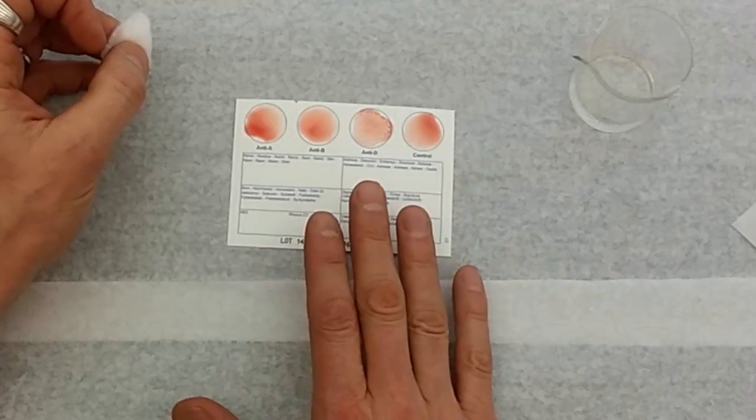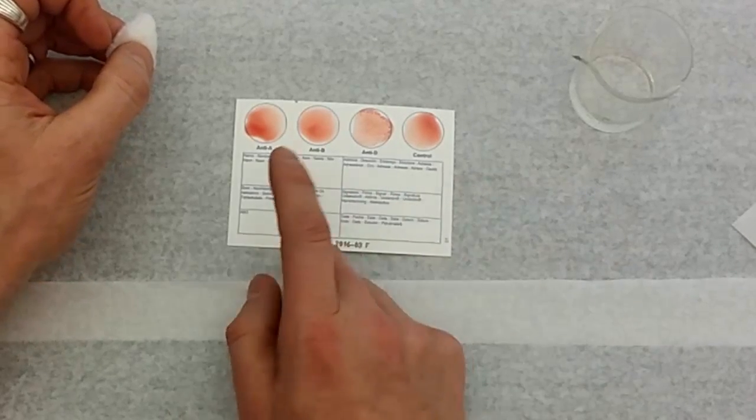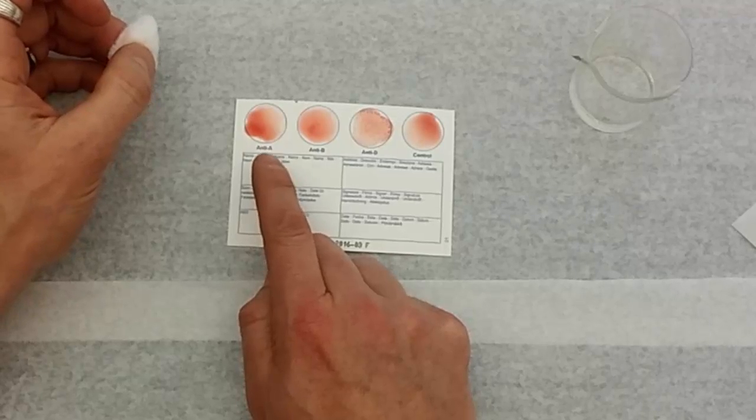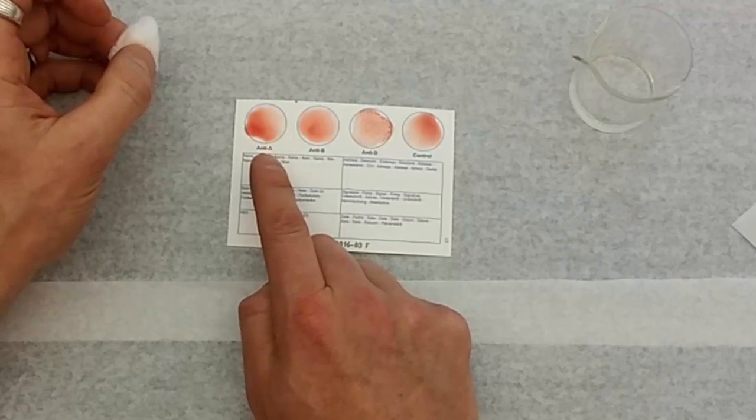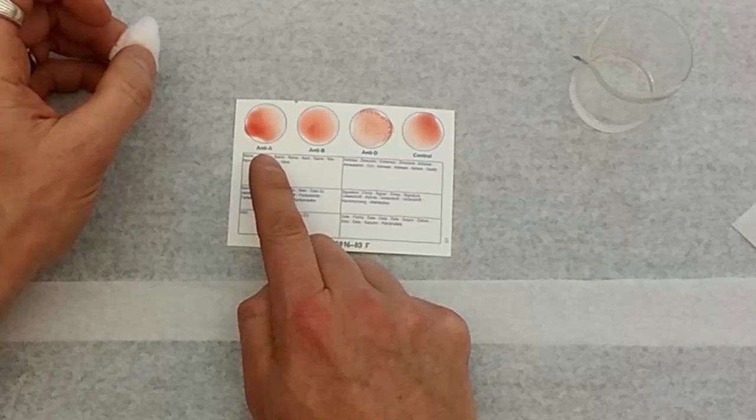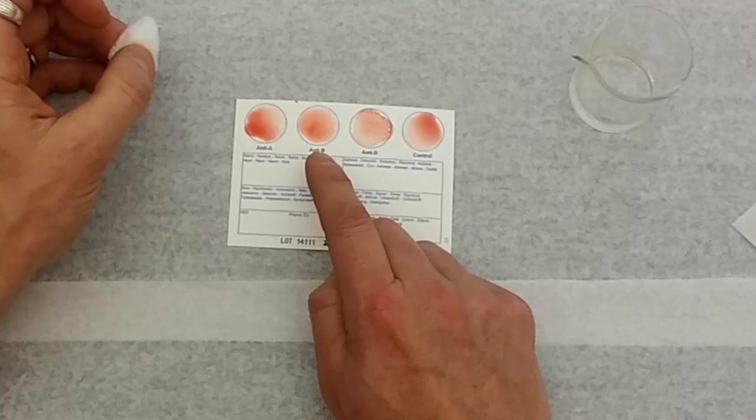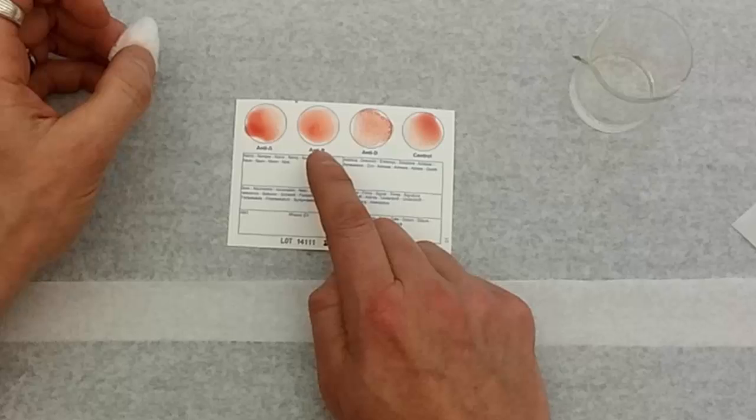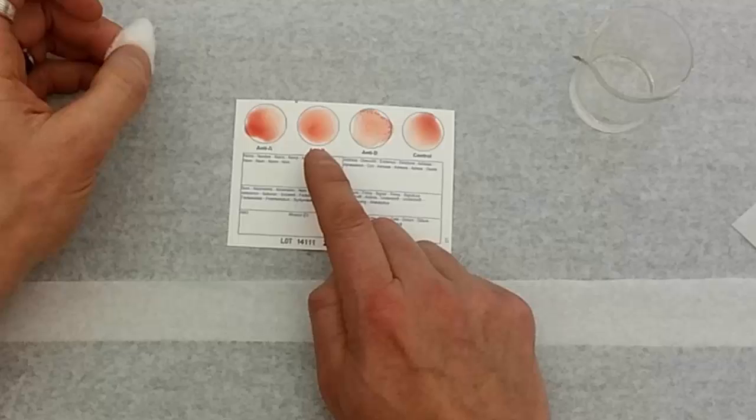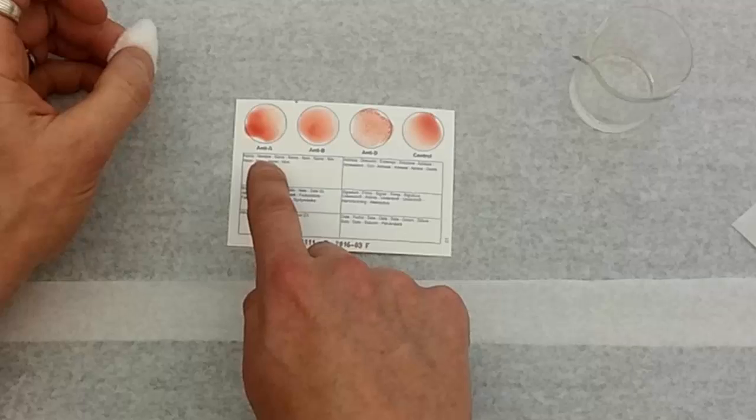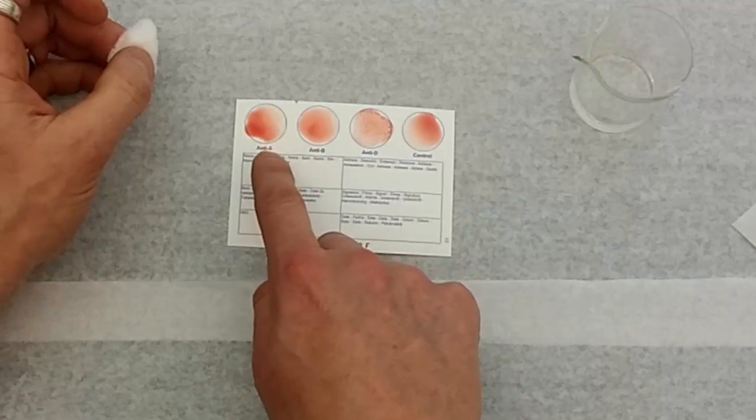Notice what's happening in the circles. I hope you can see it well. We don't see a reaction in circle A. And if you recall, circle A contained antibodies against A antigen. The lack of a reaction there tells us that on my red blood cells there are no A antigens. The next circle, circle anti-B, that had antibodies against B antigens. Since there's no reaction here, that means that there are no B antigens on my blood. At this point, just with these two circles, we can see that I don't have B antigens and I don't have A antigens. That makes my blood type O.